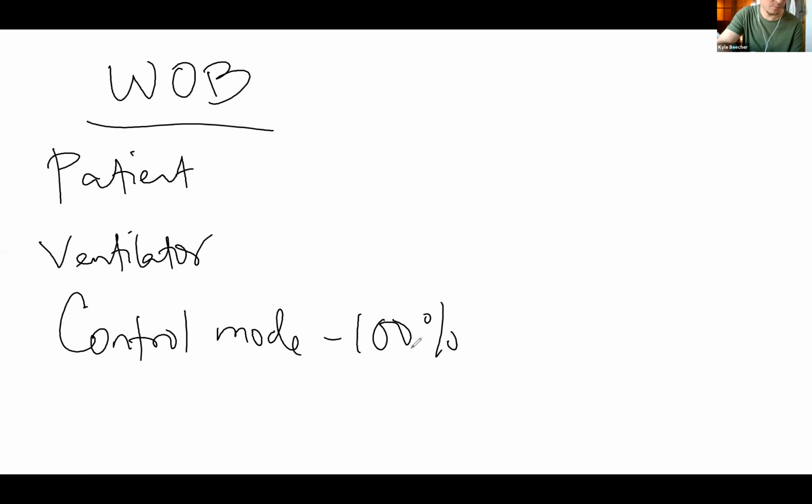Annoying, frustrating, bad. Right. So how would you feel if you were put on a ventilator wherein you cannot control how or when you breathe? The machine is 100% controlling how or when you take a breath, how much air you receive, when and how often. Would that be nice? Somebody has control over your breathing, which is one basic thing all of us need. No, the only thing the control mode will work is we have to paralyze the patient.